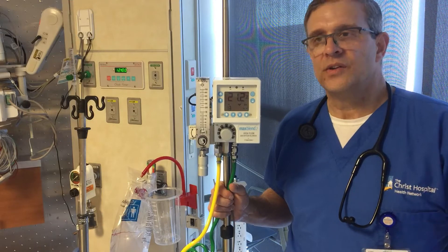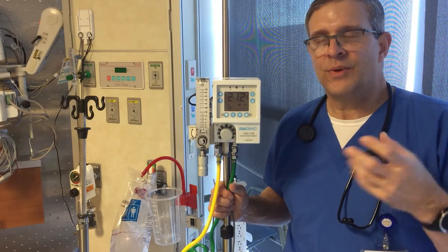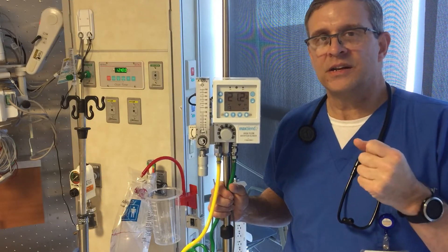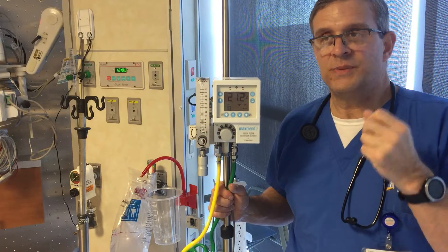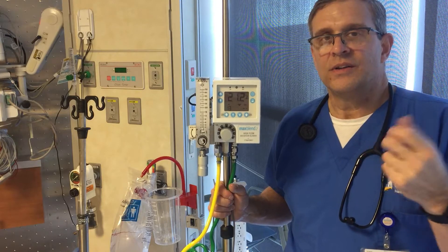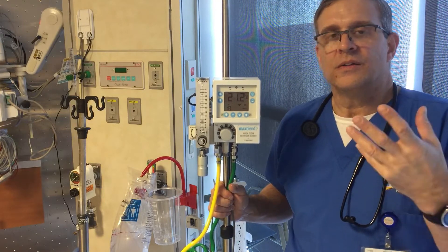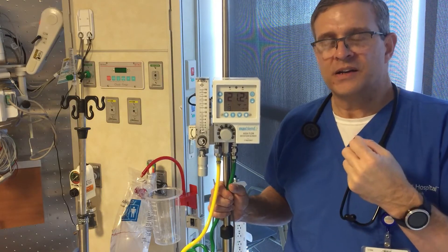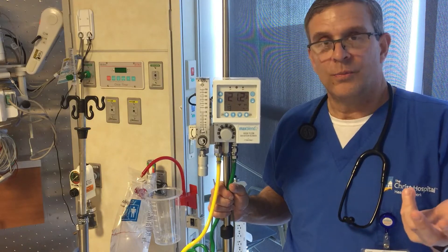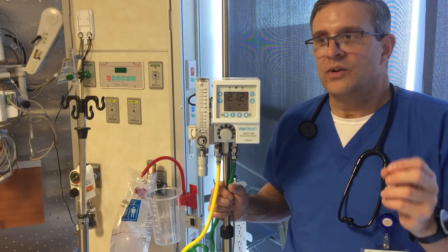In other words, the more the patient breathes in around the oxygen in addition to the oxygen being delivered, the lower the FiO2. The less room air that's pulled in around the oxygen being delivered, the higher the FiO2 is.